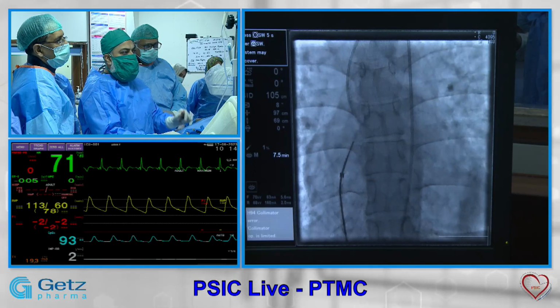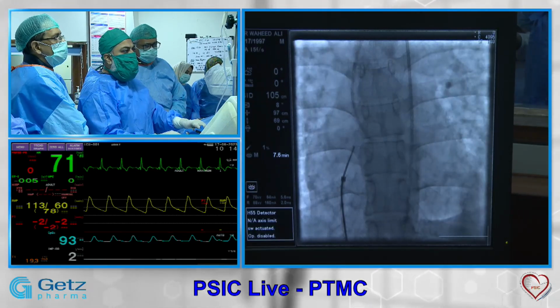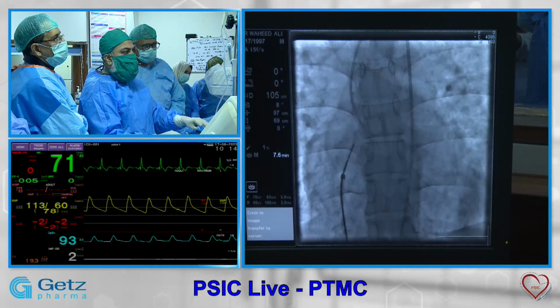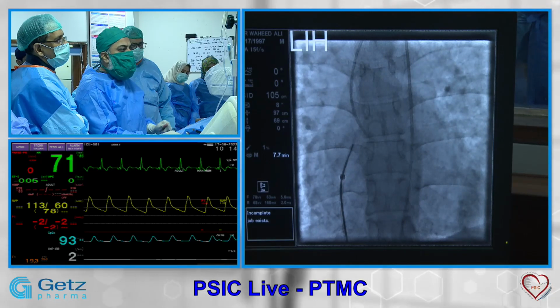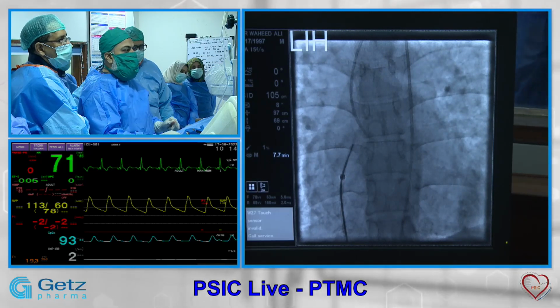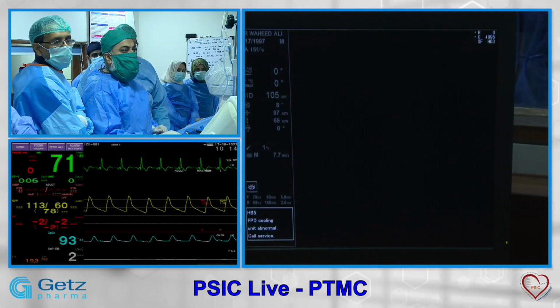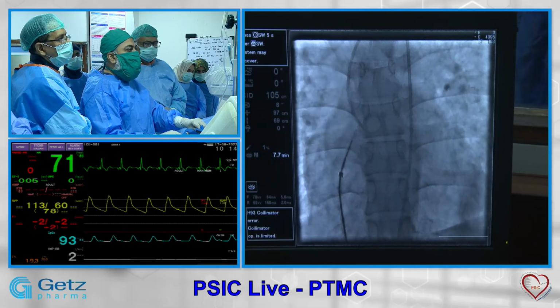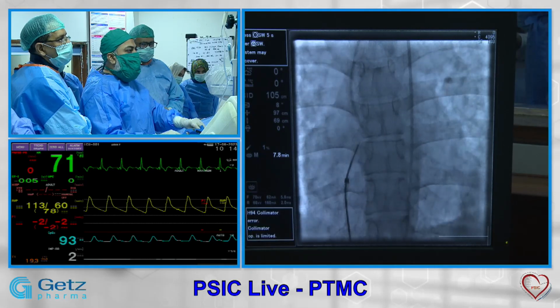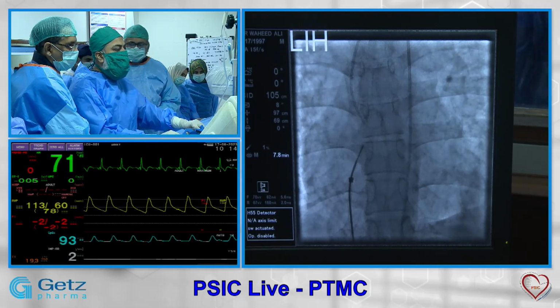And if you want to puncture lower, we usually go down and take at least one vertebral disc below the level of the pigtail. So what is your suggestion? Okay. I think we will try to puncture higher. We'll stop here and we'll go to the lateral position.